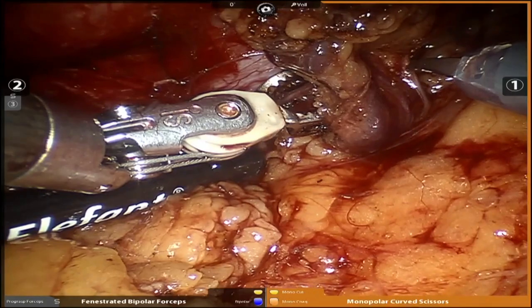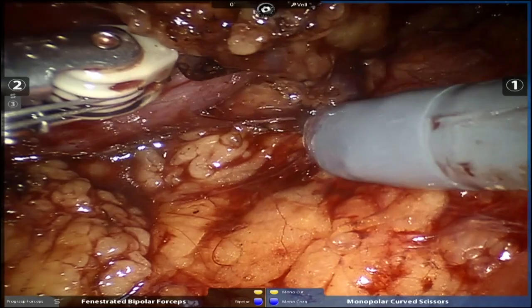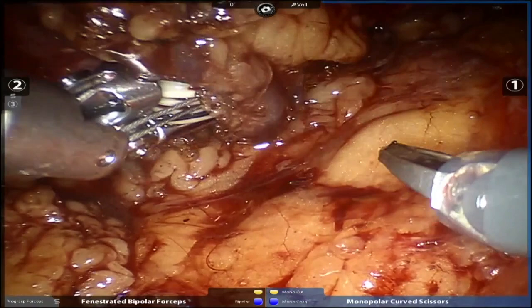Randall, let's put a Hem-o-lok on this. Actually, this is what I use it for. It may be helpful sometimes. When you just go for a segmental artery and you use the ICG, then you really see the area of perfusion, and that can be very helpful in some situations.